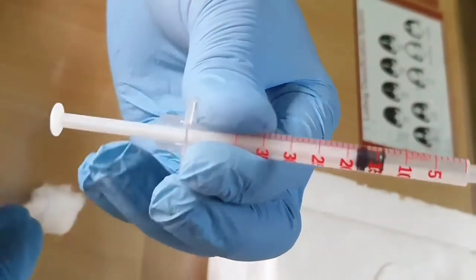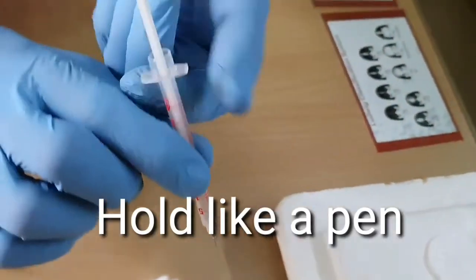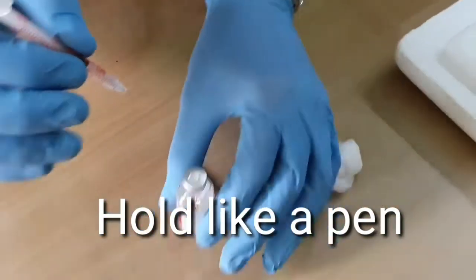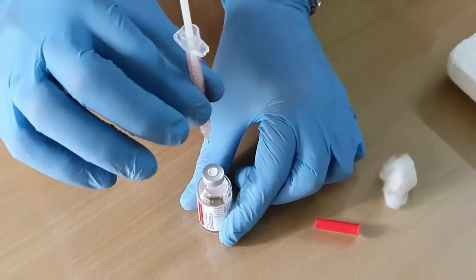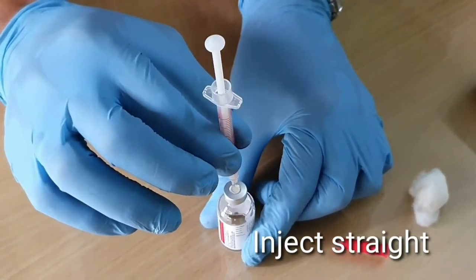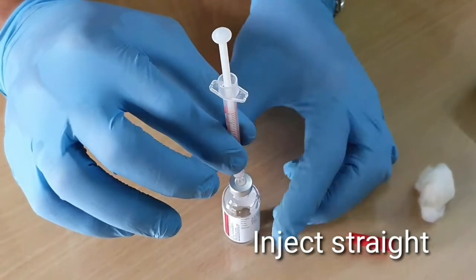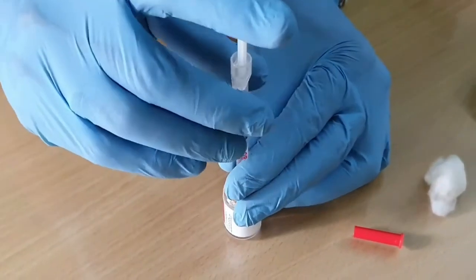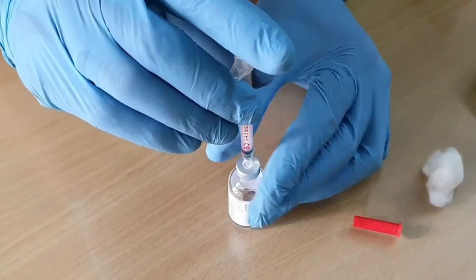Now we are going to inject. Hold like a pen and inject air by piercing it straight through the center of the rubber which is there at the bottle. Hold it there and inject the air into the bottle.